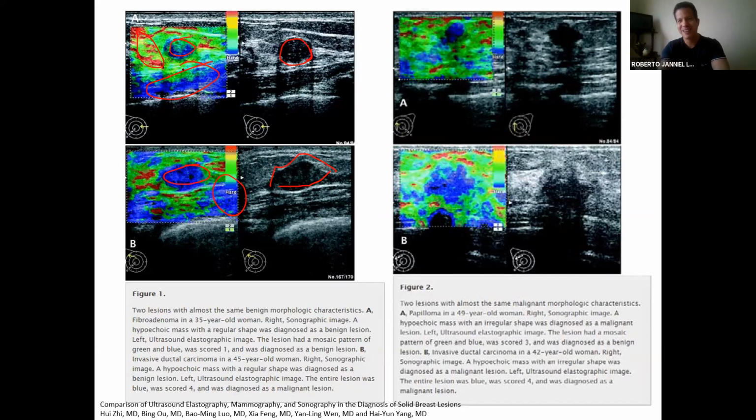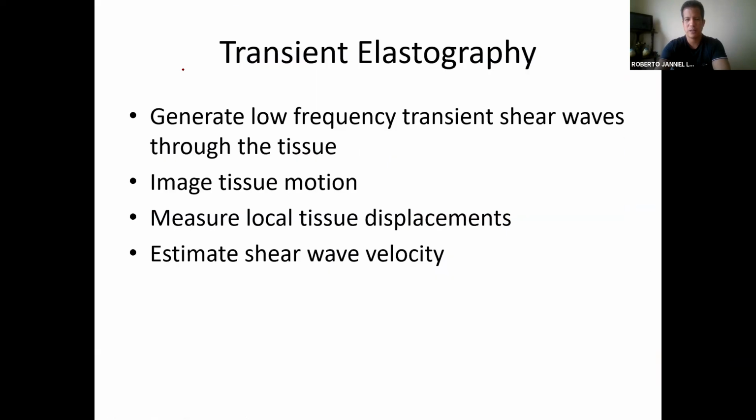There is a difference between diagnosis and detection. Look at that image over there. You wouldn't be using this for detection of cancer, in the sense that if something blue shows up then it's likely cancer, because that would be unusual. But you can use it for diagnosis. There's a lesion here. Just focus on that and see how the relative values of the Young's modulus are changing compared to the background. So that would be compression.